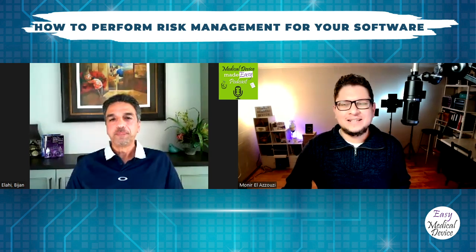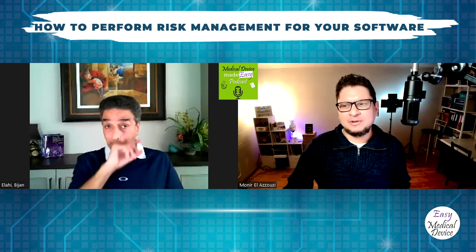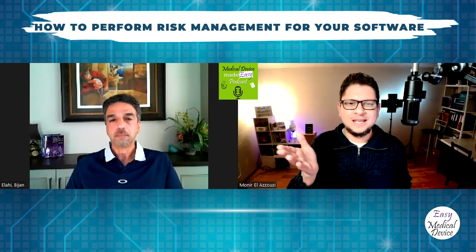No, it's great. And what is important, and I had that experience also, when we are doing those mitigation of risks, there are 3 levels of mitigation. There is a design level, there is the alert level, and then there is the information that will be provided in the instructions for use.